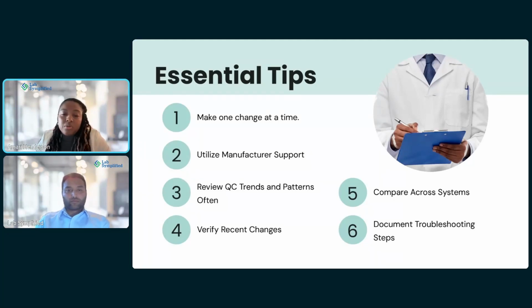Document troubleshooting steps. I think this is really important because sometimes I'll talk to customers and they've done so many steps, but they have not recorded them. They haven't kept track of what they've done, so they can't really explain what troubleshooting steps they've taken. So it's harder to assess the situation and figure out which direction to guide them in to help understand what will fix their issue.